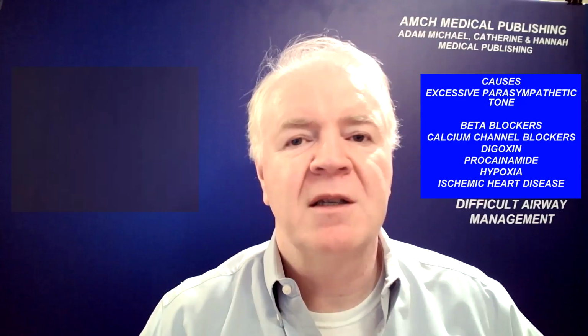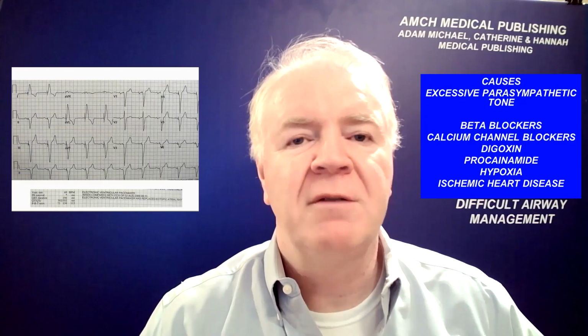Transesophageal atrial pacing is suitable only for a minority of patients already sedated or intubated. The best available temporary option remains ventricular pacing using a wire placed through the internal jugular vein into the apex of the right ventricle. Electronic pacing in this manner can actually produce a pattern of ventricular depolarization which mimics a bundle branch block.